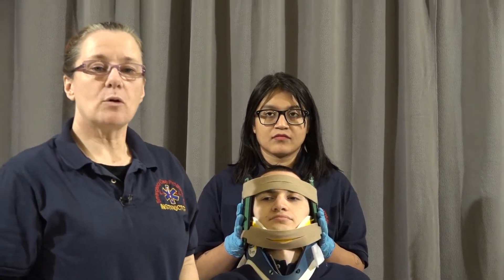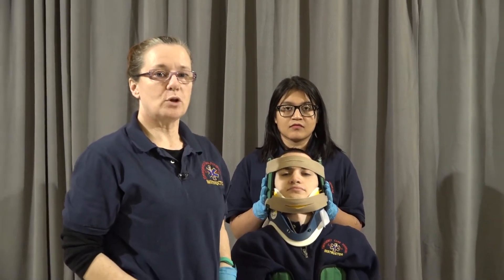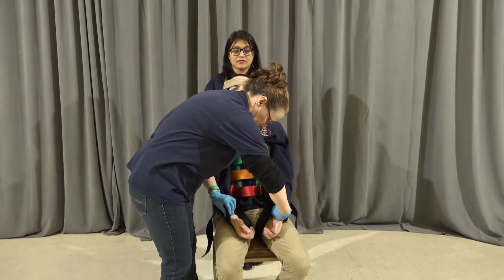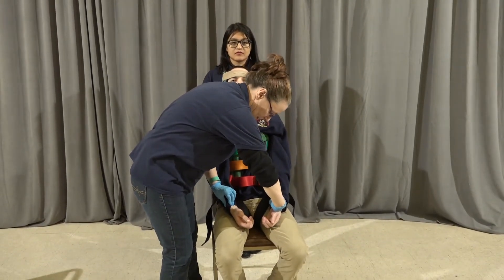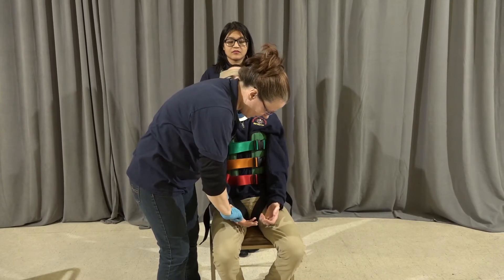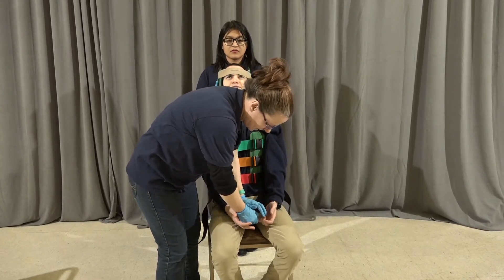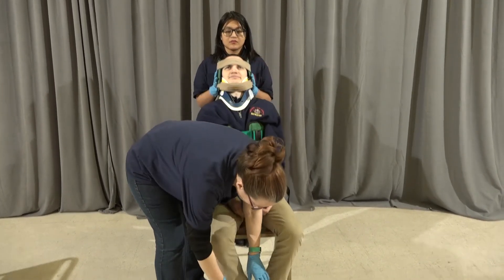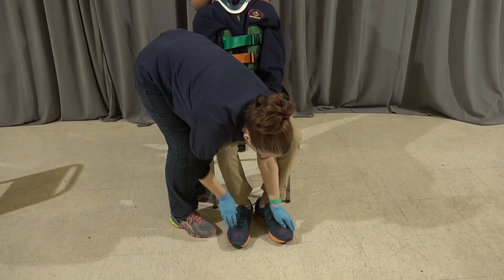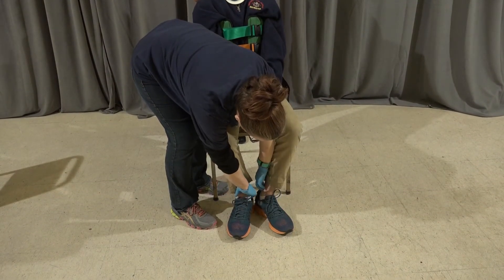Once I've completed that, I'm going to reassess my patient again for pulse, motor, and sensory. Feeling for radial pulses. Wiggle your fingers for me. Which finger am I touching? The thumb. Which finger am I touching? The pinky. Wiggle your toes for me. Which toe am I touching? The pinky. Which toe am I touching? Feeling for pulses.